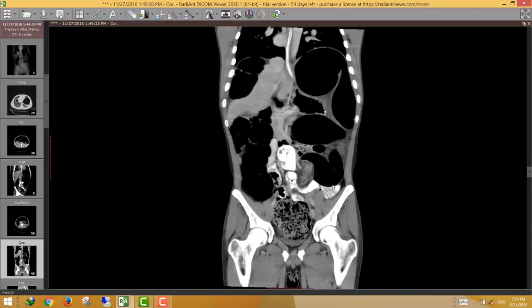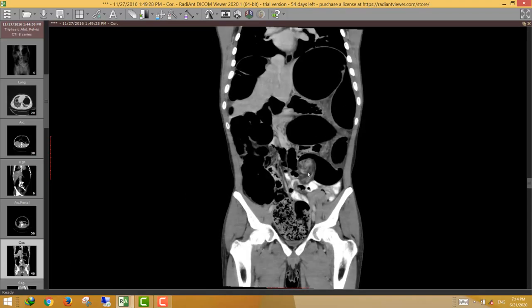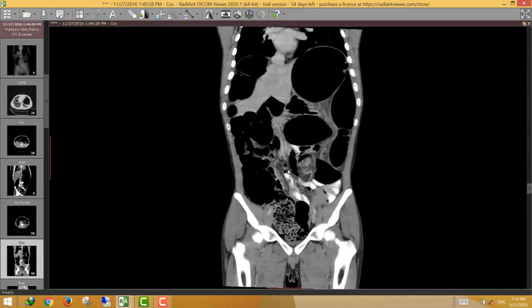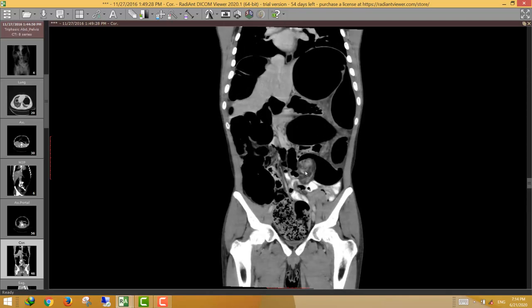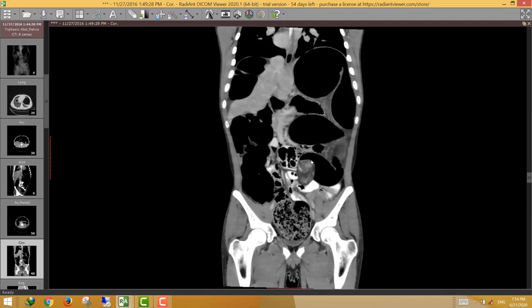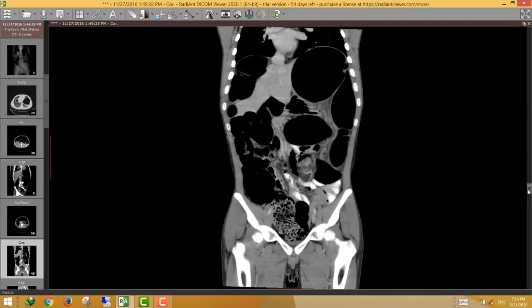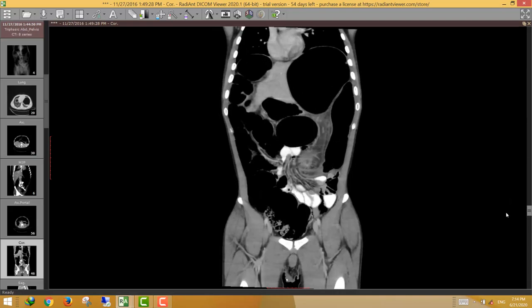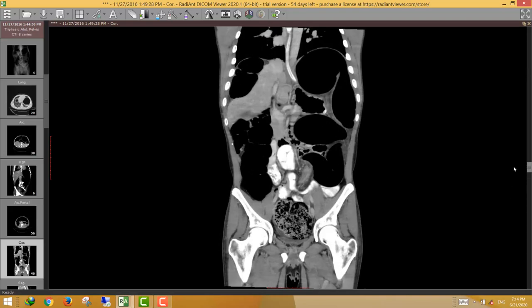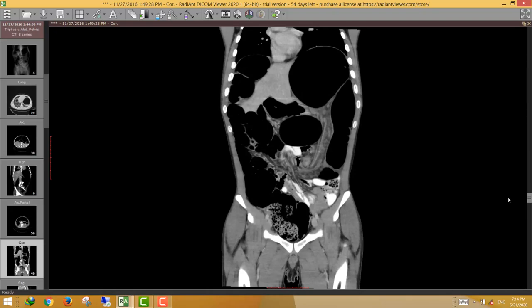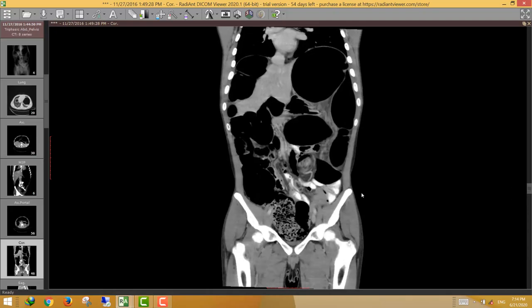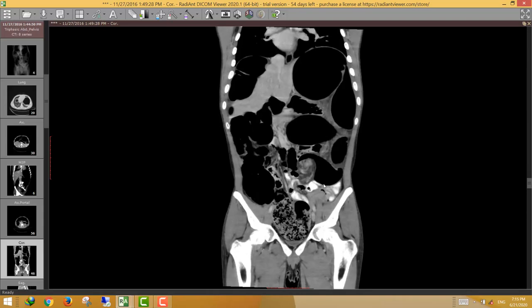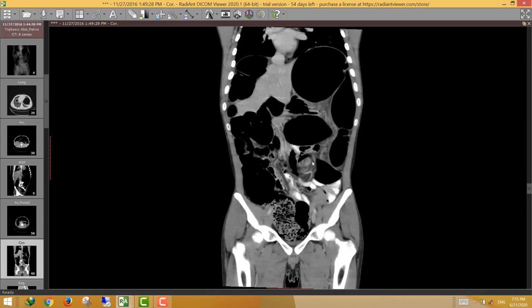The whirlpool sign should be seen on axial images. On coronal images, at the site of obstruction, we can see the characteristic whirlpool appearance — the whirlpool sign, characteristic for volvulus. This is a case of sigmoid volvulus.